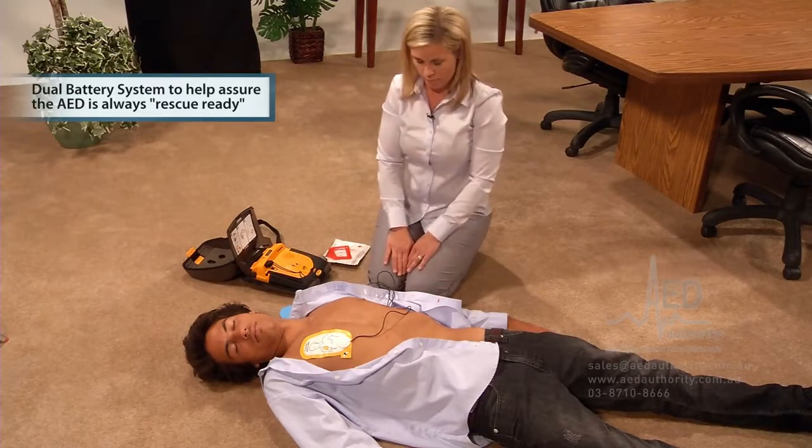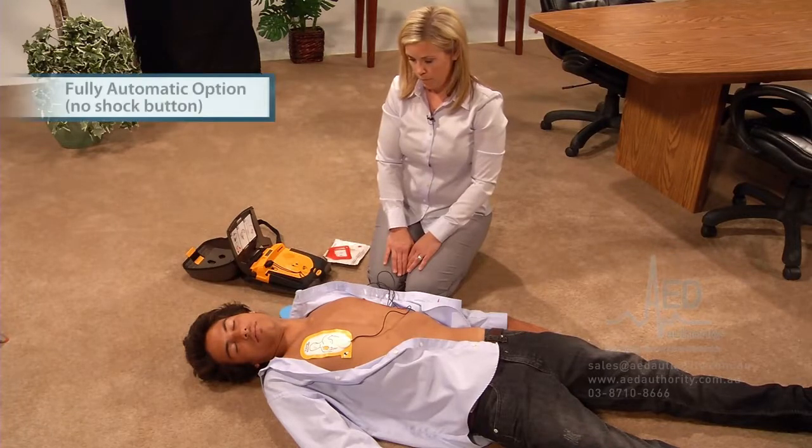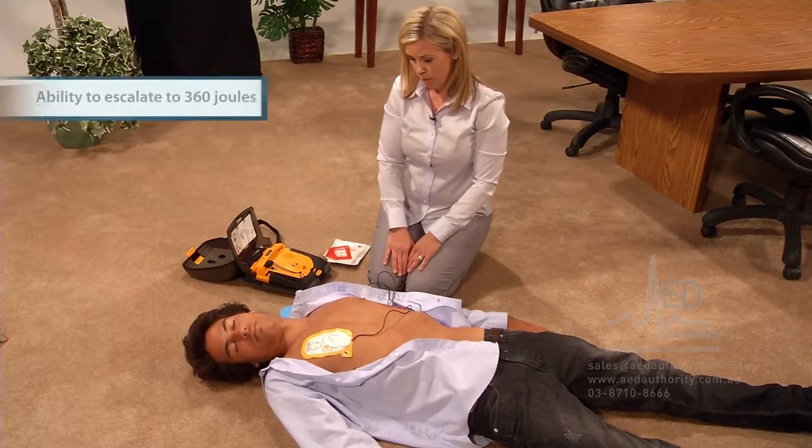If it detects a heart rhythm that needs a shock, it will say: "Stand by. Preparing to shock. Everyone clear. Do not touch patient. Delivering shock." Make sure no one is touching the patient. The AED will then confirm: "Shock delivered."